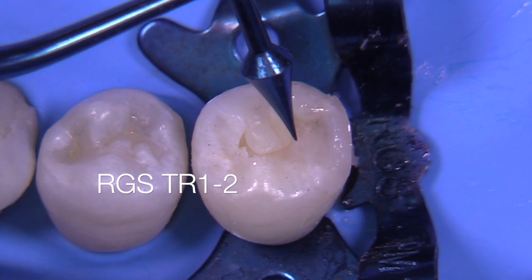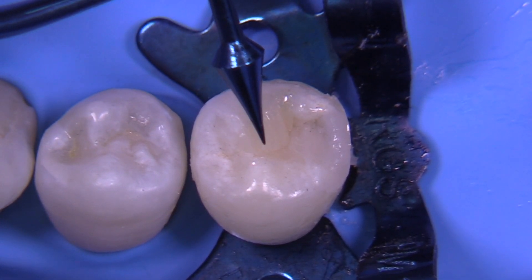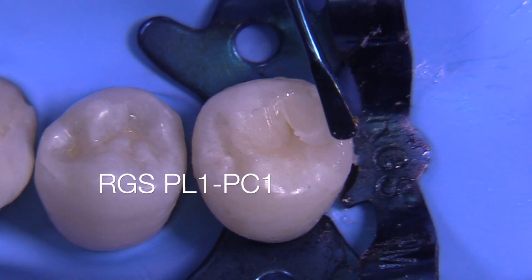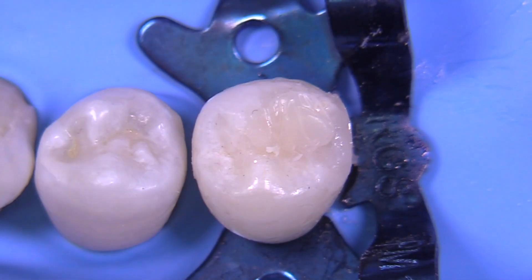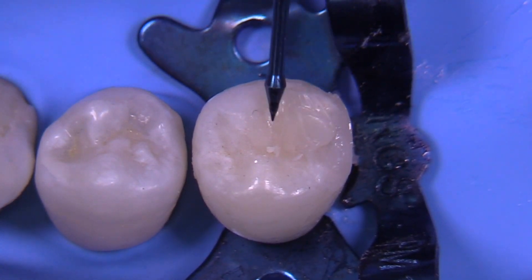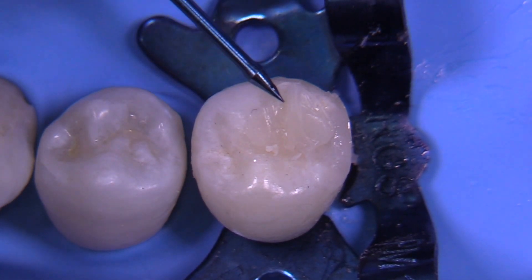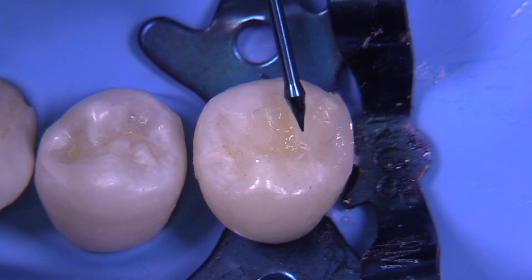Now of course we cure these incrementally — we're using the wall-and-lobe technique, a very routine approach in our practice. By doing these increments we can focus on one part of the tooth at a time and don't have to worry about polymerization stresses as much, because our increments are small. It's nice to have control over one area at a time so we can keep our mind focused on just what we're trying to do in that precise local area with our loupes on.